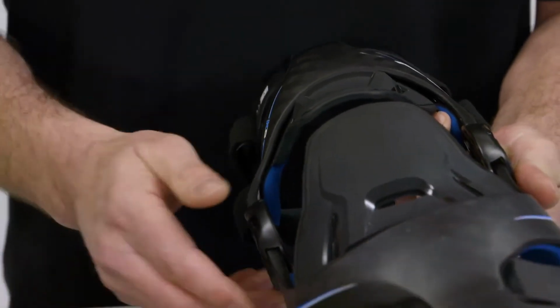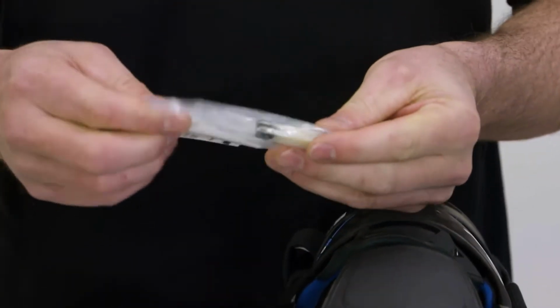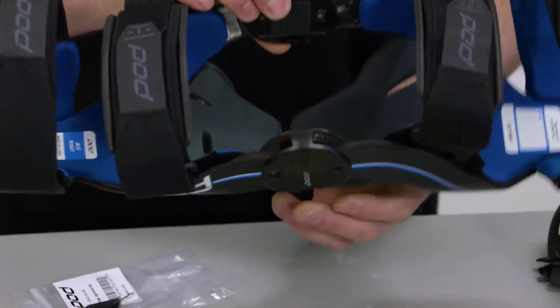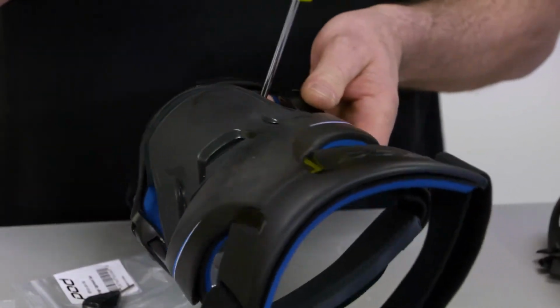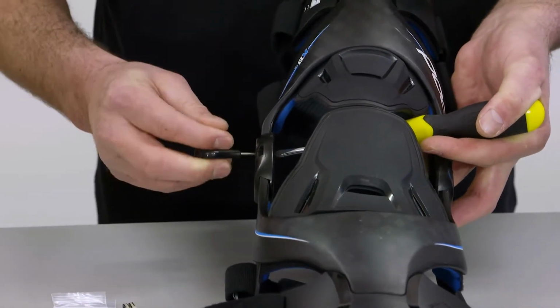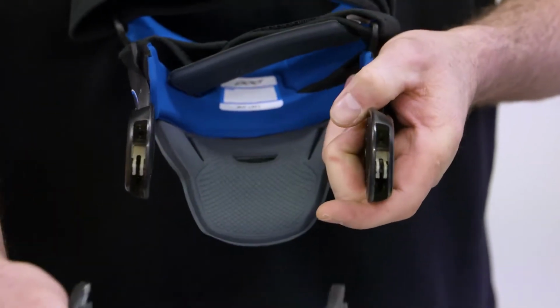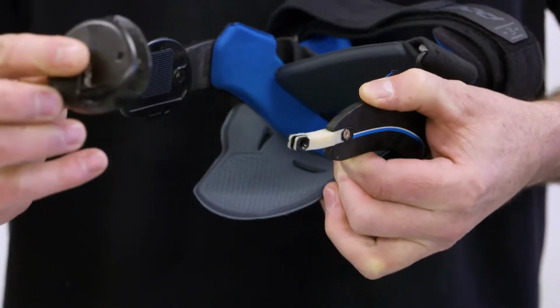And now you can use the tool that comes in the ligament set to undo the screw that's holding the lower frame to the hinge housing. You'll need a flathead screwdriver, so the flathead screwdriver will attach to the inside of the screw, and then you could use the tool on the outside to undo the screw. Now that we've taken the screws off the lower hinge housing, we simply slide the lower frame off. With that lower frame off, the hinge housings will slide off from the ligament and the upper frame.